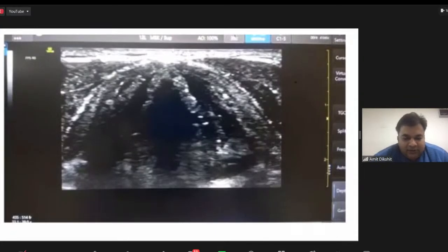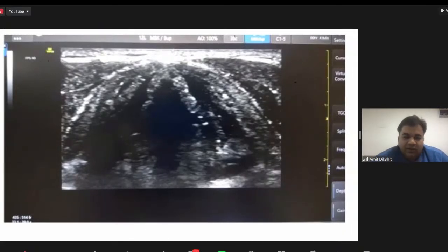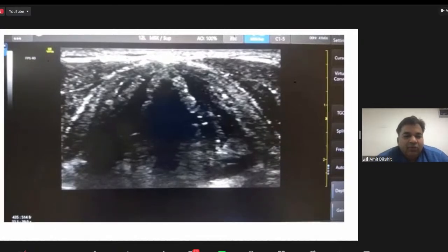And then after placing the LMA, we can see the movement of vocal cords very well. Most of the time after thyroid surgery, when surgeons ask, most of us do laryngoscopy, and I find it very barbaric. 90% of the time, nobody sees anything, and everybody says, yeah, sab theek hai, everything is fine, and we just move on. And this is a ritual more than a scientific thing.